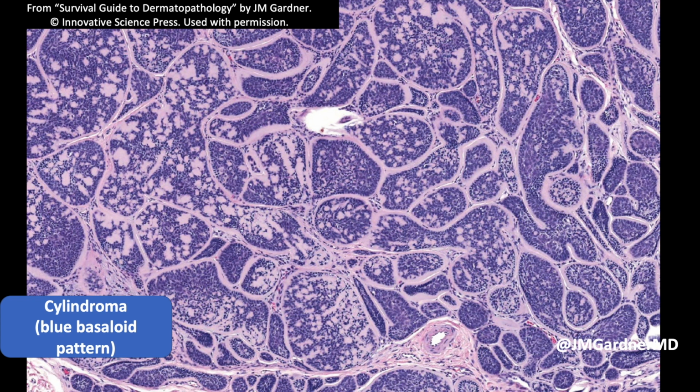In spiroadenoma, they're packed really closely into those big blue nodules, but here in cylindroma, they make small nests of varying size and shape, and those nests mold and squish into their neighbors and conform to the shape of their neighbors. See how the nests all lock into each other like puzzle pieces. So some people say these are like puzzle pieces. Ed Fulton, my former fellow, liked to say they look like spots on a giraffe.